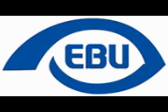And I'm not going to go into this because we're out of time, and that is a lot more complicated than working with the Keyboard Manager. So Keyboard Manager is definitely the first thing to master. But if you get to the point where you say, oh yeah, to simulate the Windows key, I press .4 with .8, can we do better than that? Yes, we do. We can do better than that. And there is information about this. If you can find it, perfect. If you cannot, just send me an email.